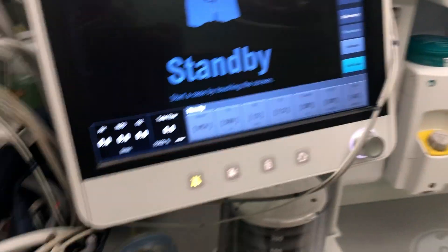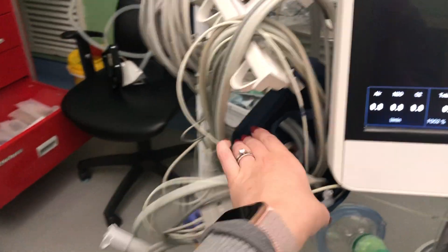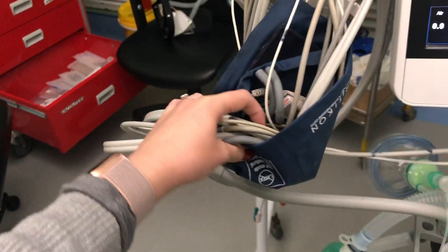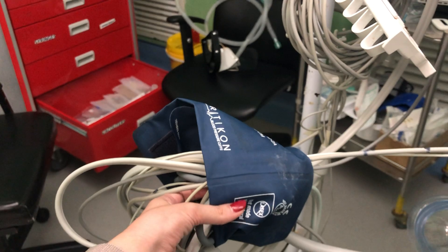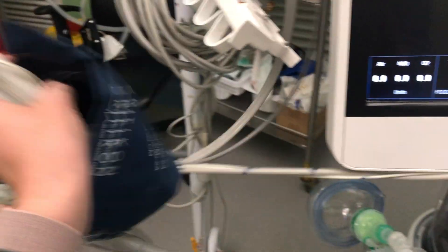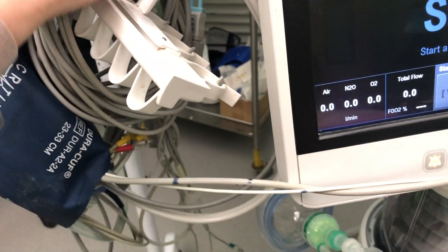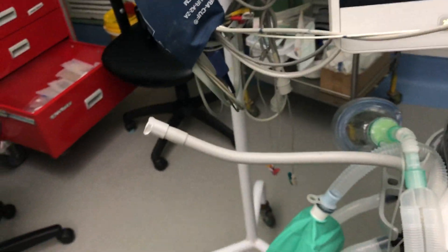Certain things must connect from the anesthetic machine to the patient. This includes all monitoring equipment — the basics being your ECG, pulse oximeter, and blood pressure — all of which connect to the patient.